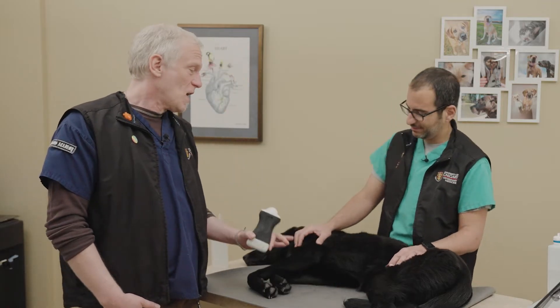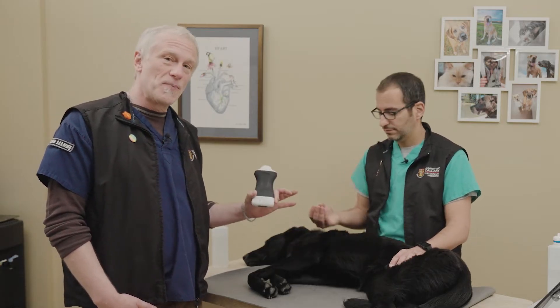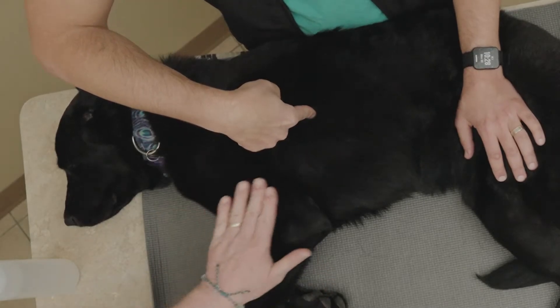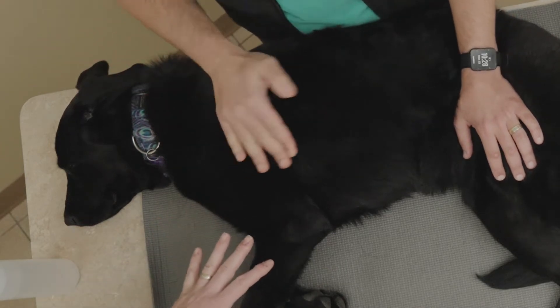This is going to vary depending on patient positioning. Our volunteer Penny here is in lateral recumbency. We can look for pneumothorax in lateral recumbency. We have to think about where that pathology will accumulate based on patient positioning. In lateral, that's going to be the highest point of the chest, because air rises. So we have to find that cap of air with Penny in lateral recumbency. But most of our patients coming in with a pneumothorax are going to be more comfortable, and we want to scan them in the position they're most comfortable in — a sternal or standing position.